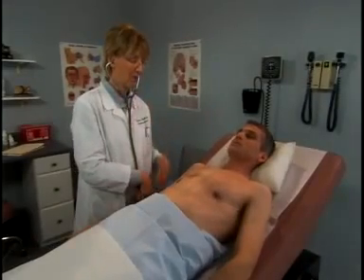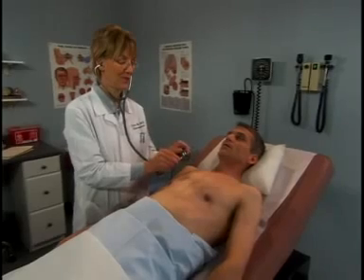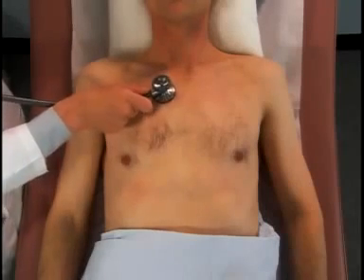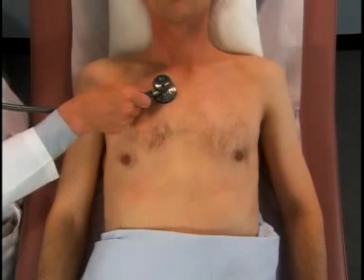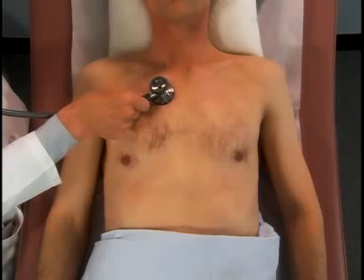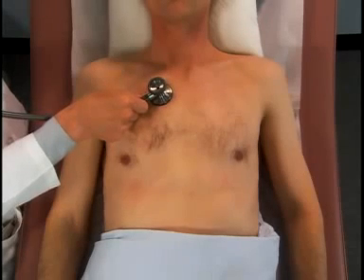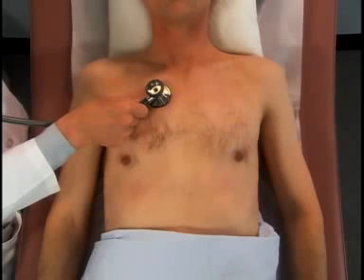Adjust your stethoscope so that you will be listening through the diaphragm. Begin listening in the aortic area at the right second interspace close to the sternum. Starting in the right second interspace helps orient you to the cardiac cycle. Note the cardiac rate and rhythm. Normally, the rate is 60 to 100 beats per minute, and the rhythm is regular.